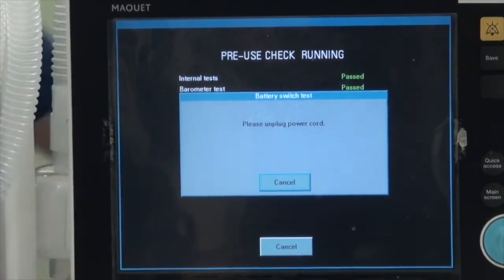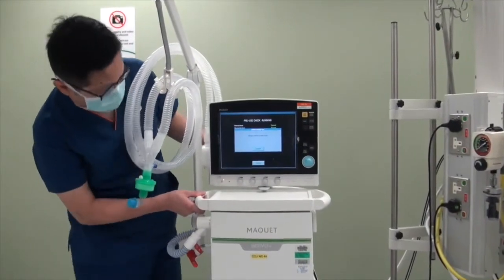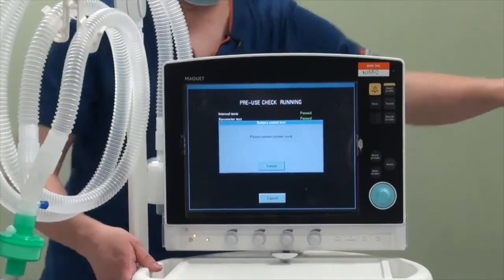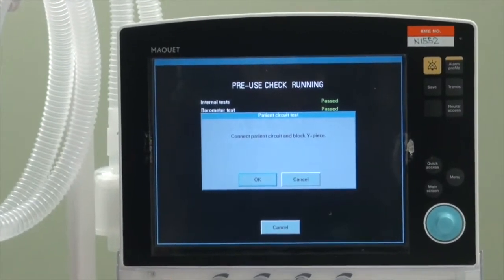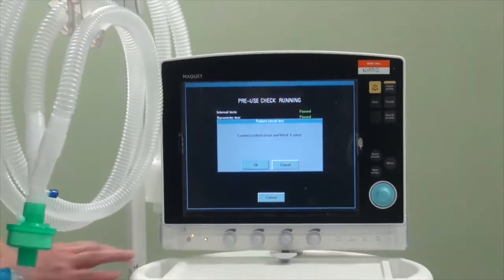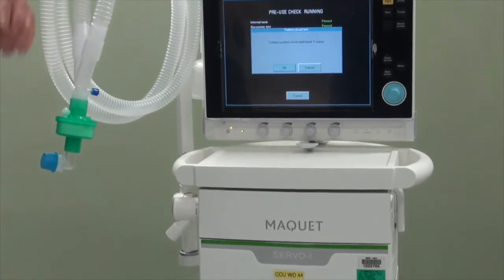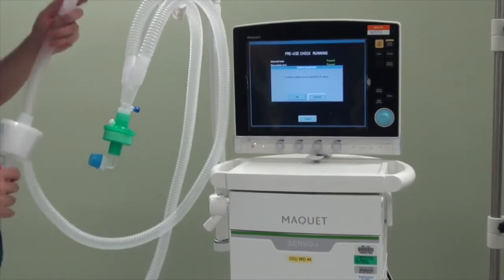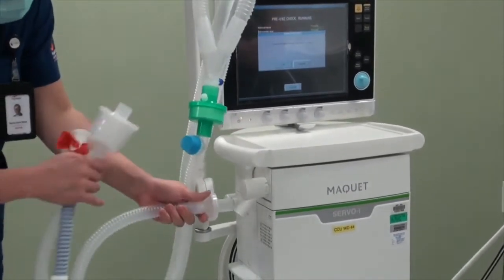This is the part where they ask you to disconnect — switch off the power supply, then restart it. Now it's the part where we connect the patient circuit. Take out the gas tubing and connect the inspiratory limb with the bacteria filter to the inspiratory inlet.